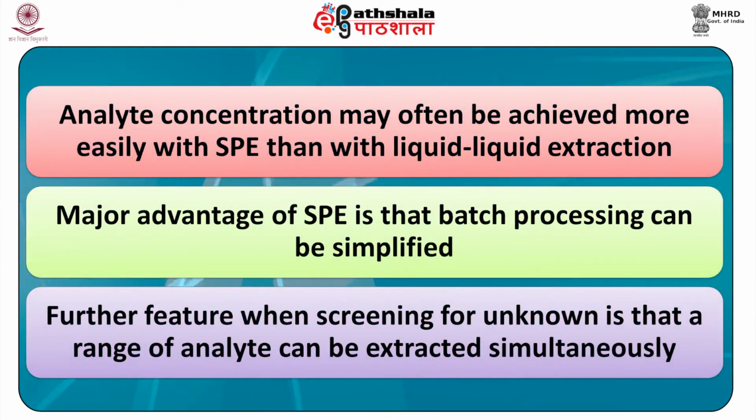Analyte concentration may often be achieved more easily with SPE than liquid-liquid extraction, as use of an SPE column to concentrate an analyte from the solvent extract may provide a quicker and possibly safer alternative to solvent evaporation.